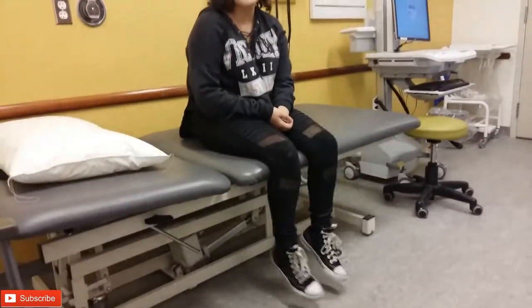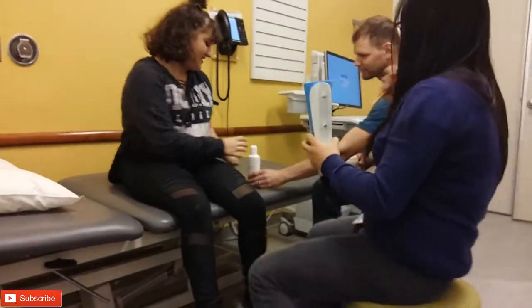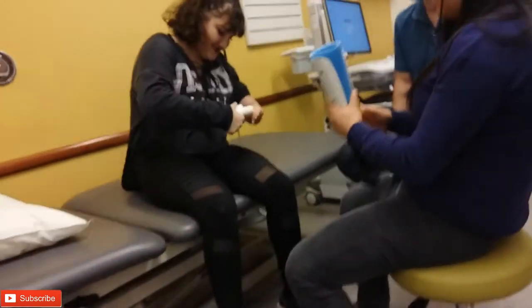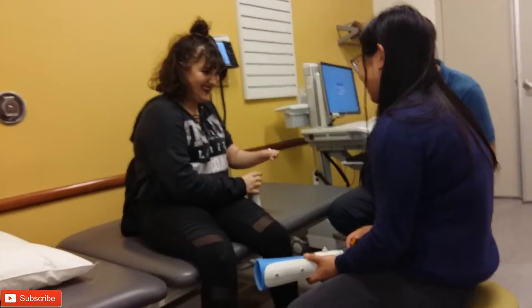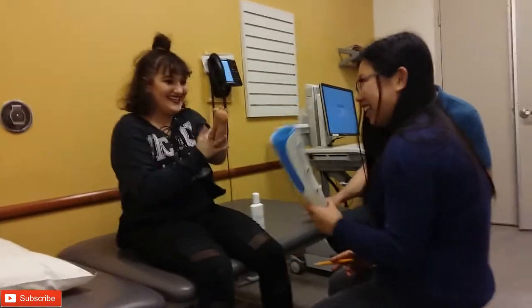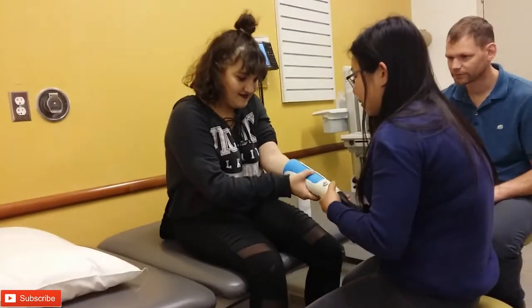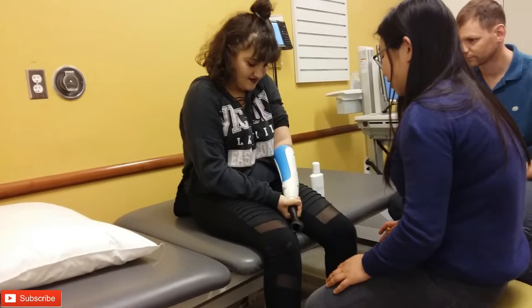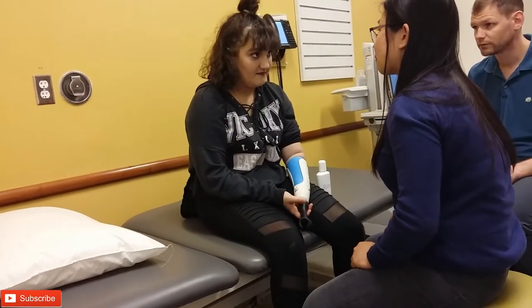What else are we doing today? This isn't the sticky stuff, right? I tried to catch it, I wasn't fast enough. It's not sticky stuff — it's not that you don't see it. She's excited, she's splatting it everywhere. So this is a silicone material, same idea. Push through — oh, it feels way more comfortable. Do you feel like you're hitting the bottom? Yeah, I am hitting the bottom. Any discomfort? No.